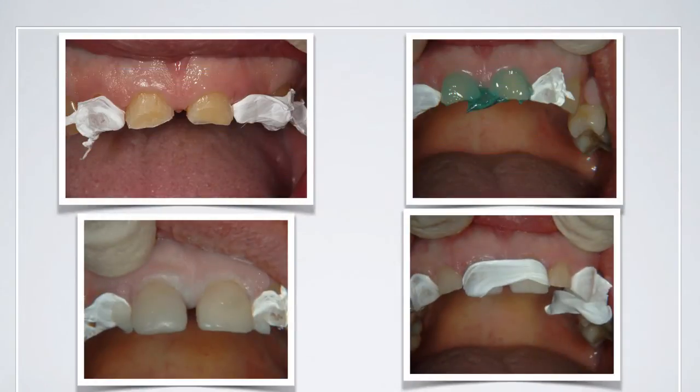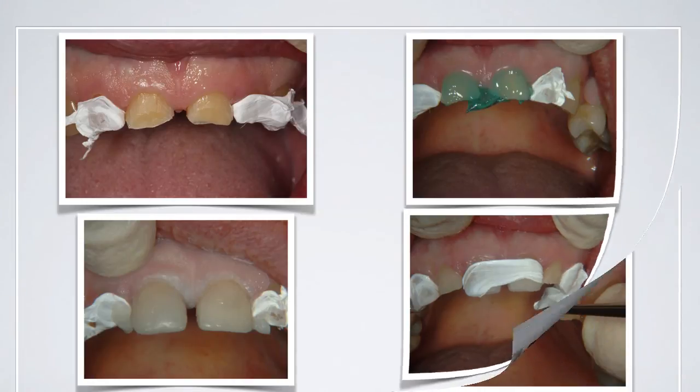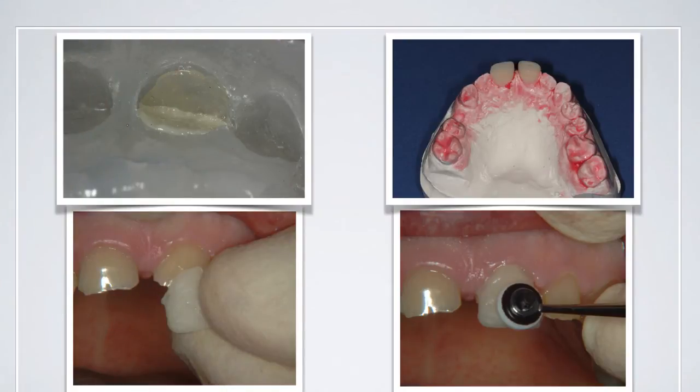Some slight alternatives to the method: Delwyn had a nice diastema between his front teeth, so we were able to put some PTFE tape on the adjacent teeth, etch and bond the teeth, and take the composite straight home. Then we put the PTFE tape on the laterals and the centrals and placed the composite. You can also use a separating medium on the model and use the impression to fabricate an indirect restoration, which you can then clean, tidy and bond directly — and that might be more suitable for either you or your patients.